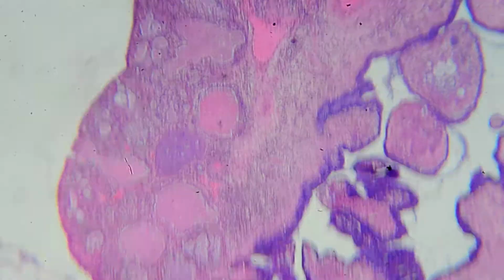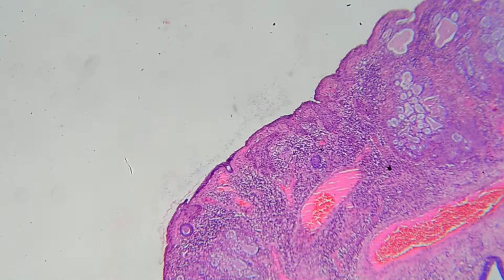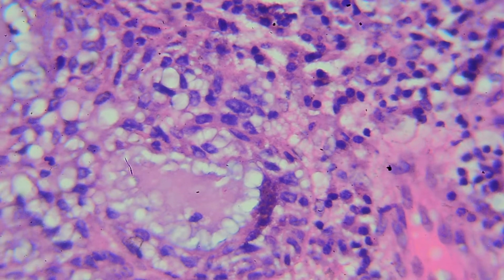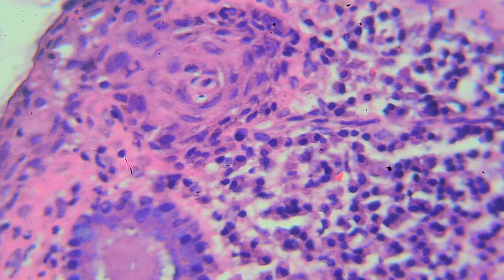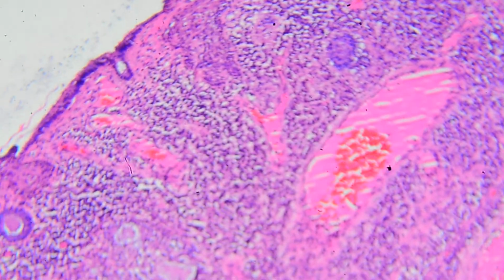What other important things? So there's always chronic inflammation. All the dark blue dots, that's usually chronic inflammation. You go higher power, and all these dark round blue cells are chronic inflammatory cells. Some of them look like plasma cells. So the polyp just results from chronic inflammation. And you can see blood vessels and fibrovascular tissue.